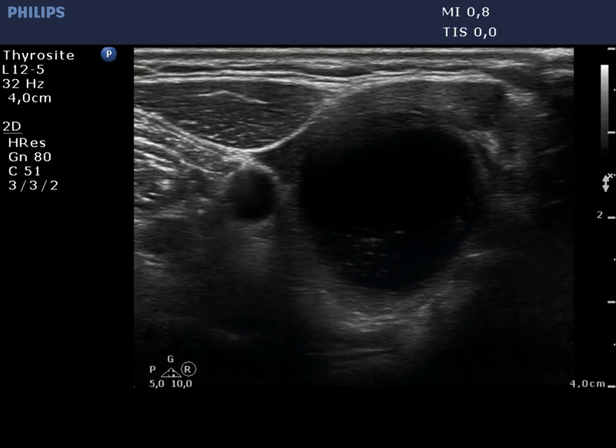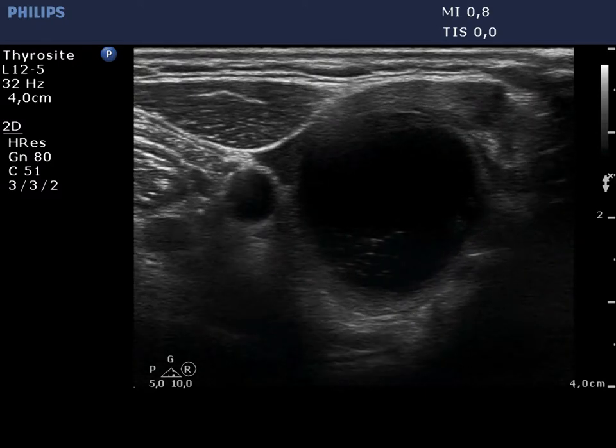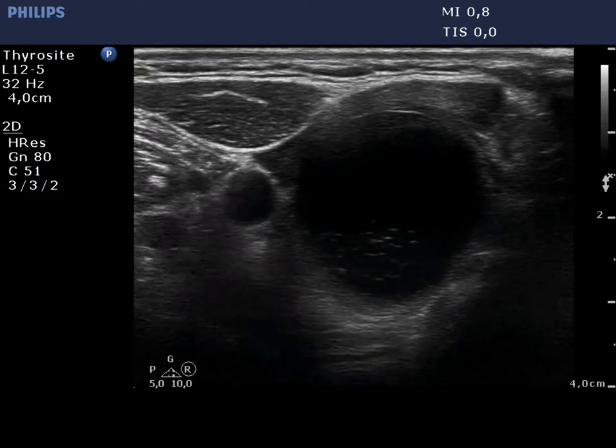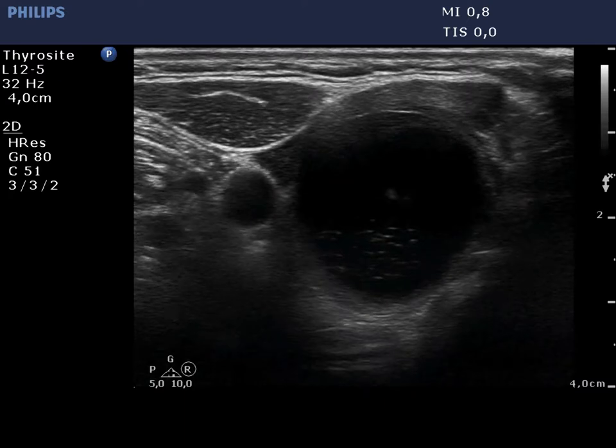First, we present a ultrasound-guided aspiration of a large cystic nodule located in the right lobe.